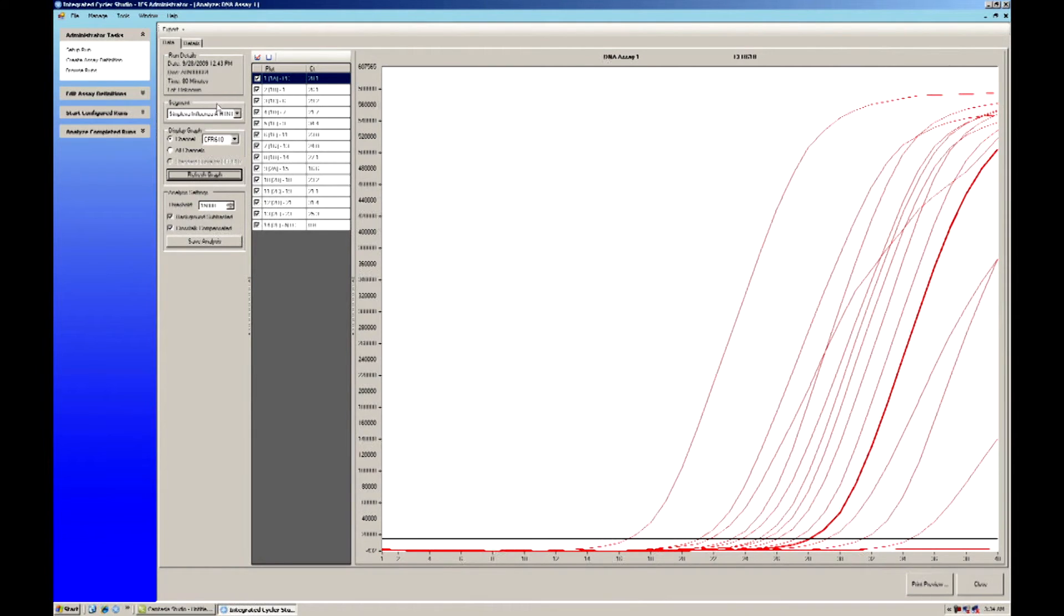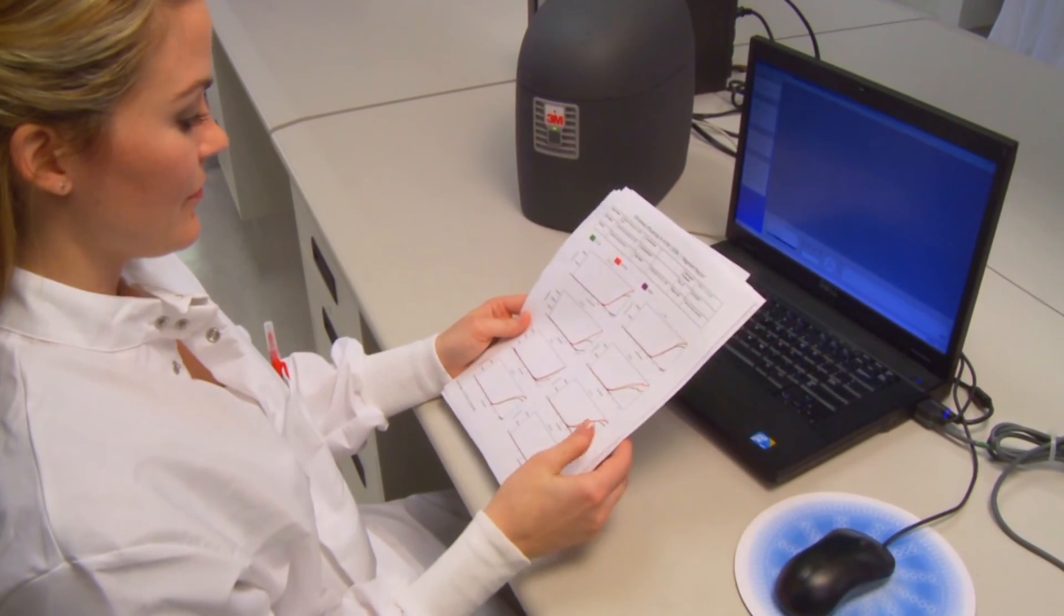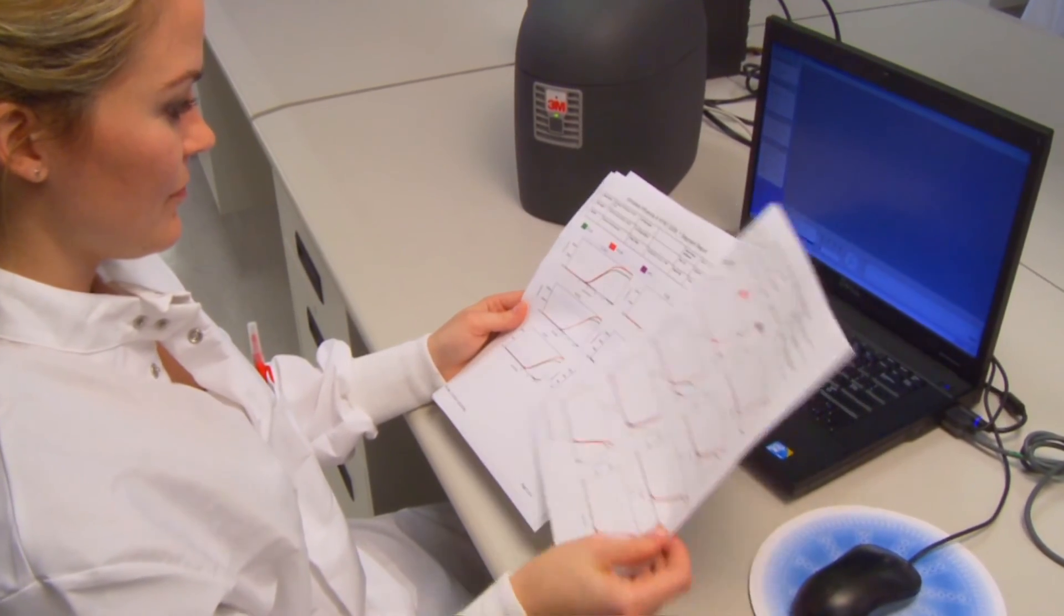For analysis, select your completed run and open the analysis screen. You can view or print color printouts with or without graphs for easy reviewing or download the analysis directly to LIS.